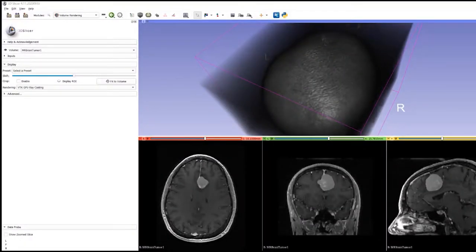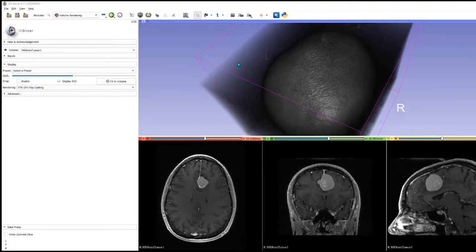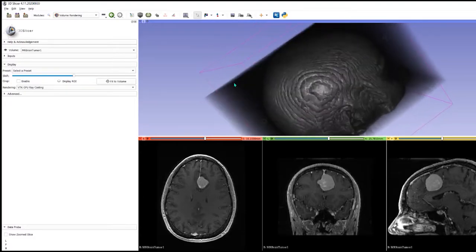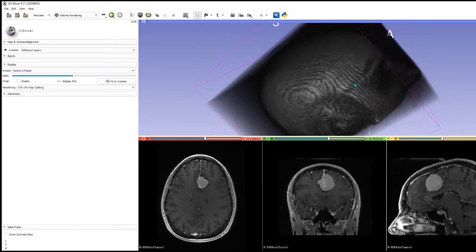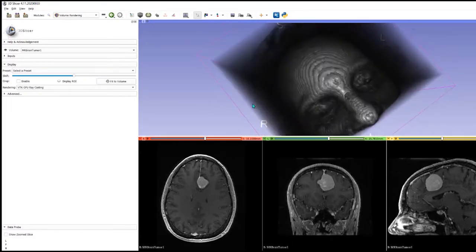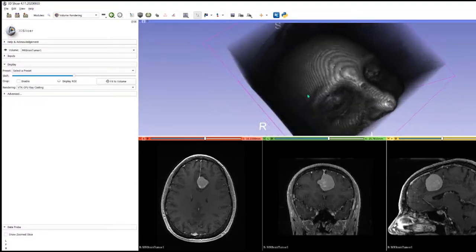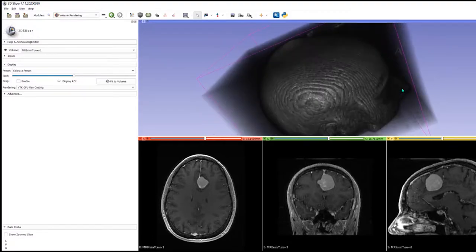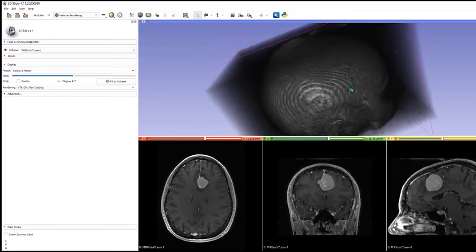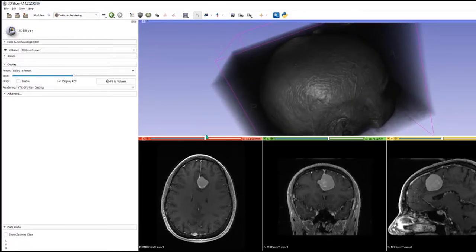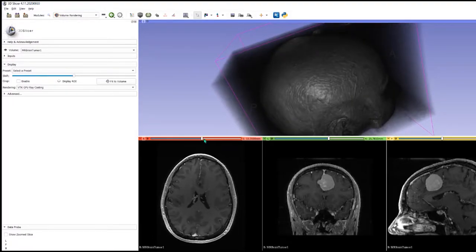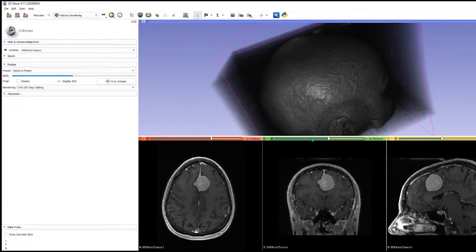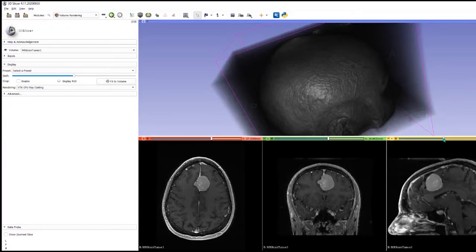This is just a quick demo of some AI artificial intelligence method for segmenting and thresholding a tumor. Here we've got in this volume an unfortunate chap who has a brain tumor which you can see on this lower section quite clearly. Now in order to threshold and segment this tumor, we need to define a particular set of intensities.